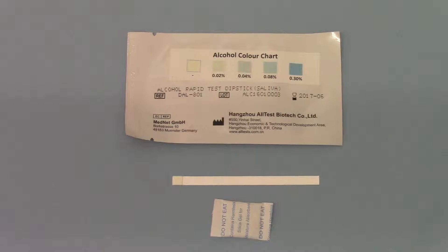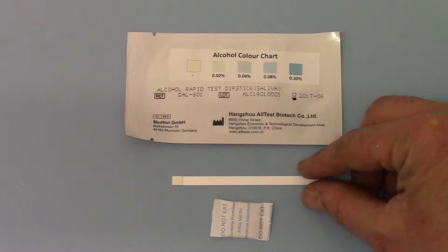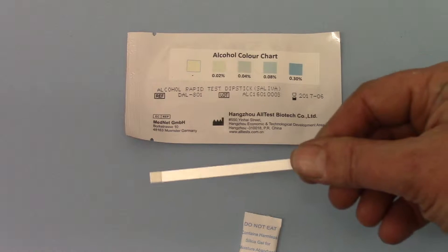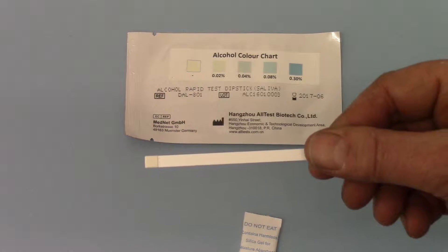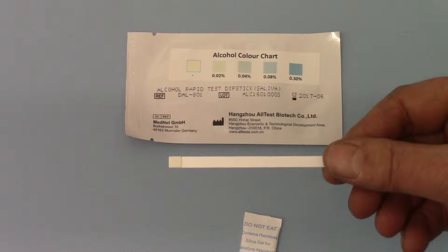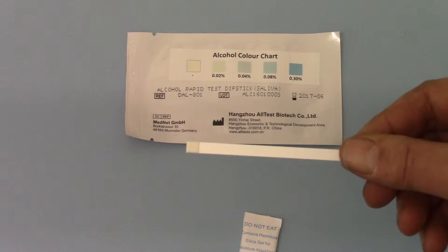Welcome back to part 2. Here we have demonstrated the contents of one of these foils — here's a reverse of the foil shown above. The contents you get out is one dipstick, and you'll see that the reactionary pad, the test pad, is just a single square pad on the end of the test strip.